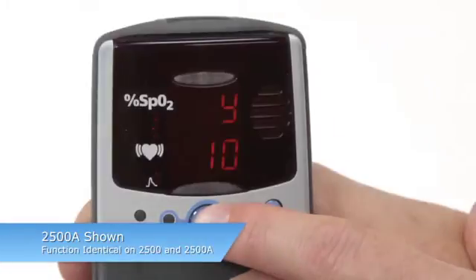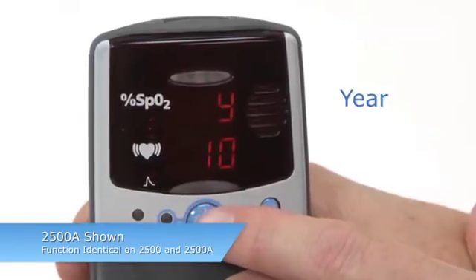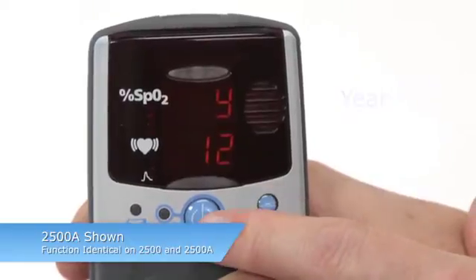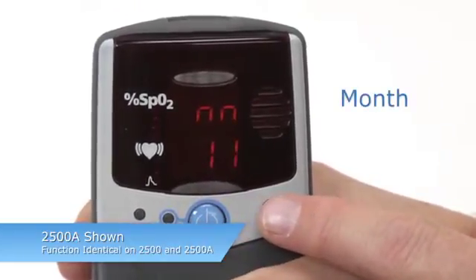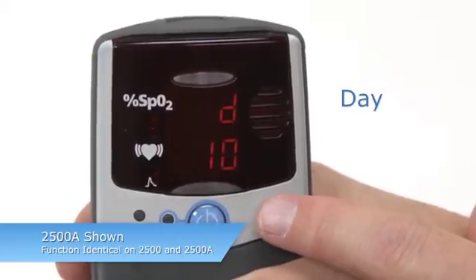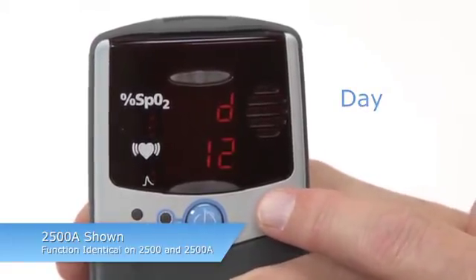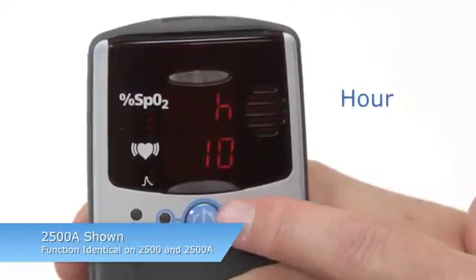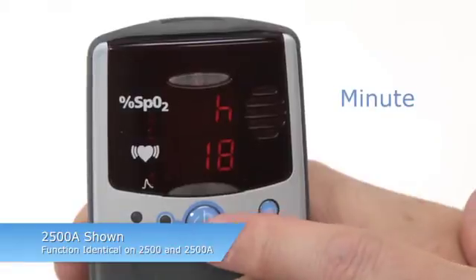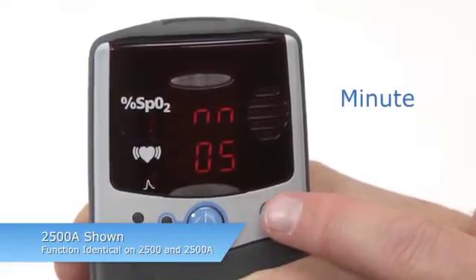Year, month, day, hour, and minute will appear in that order as you adjust them. Change the value by pressing the ADVANCE button until the desired value appears, then press ON-OFF to set that value. The next value will then appear. You can also scroll through values by pressing and holding the ADVANCE button. Once you set the minute value for the clock, you will exit Setup Mode.